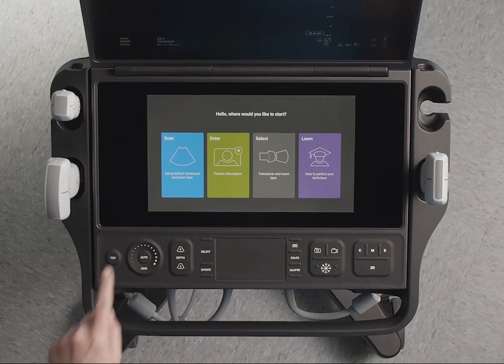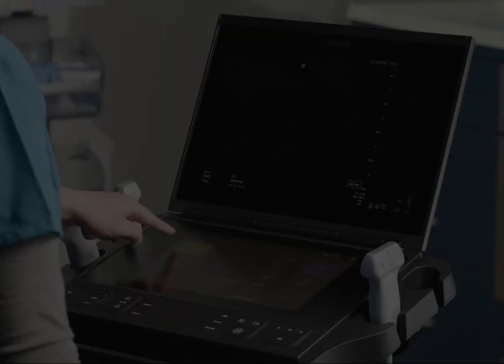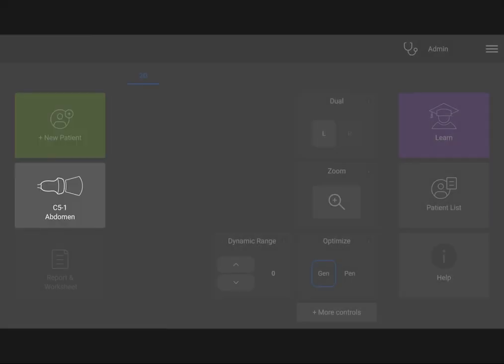Use the touch panel to navigate to different screens. There, you can enter patient information, choose a transducer and exam type, view reports and worksheets, and navigate to the Learn feature to view scan-along educational tutorials.